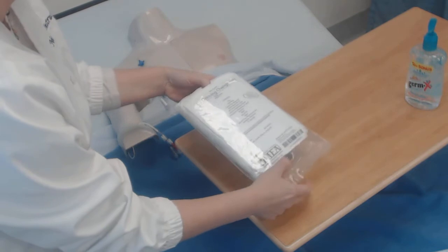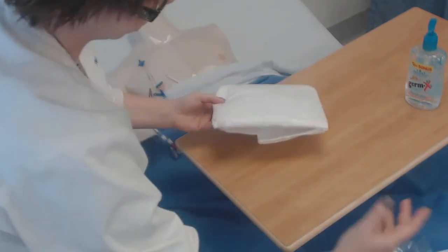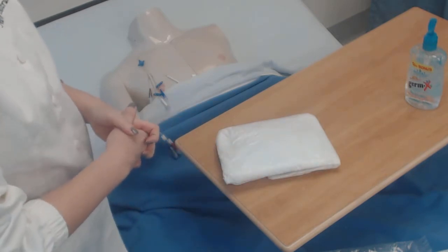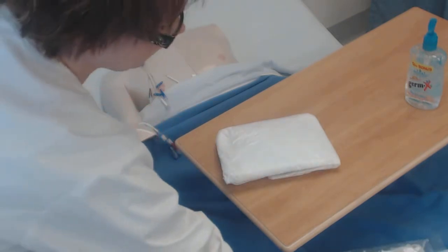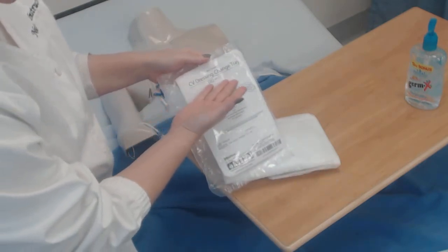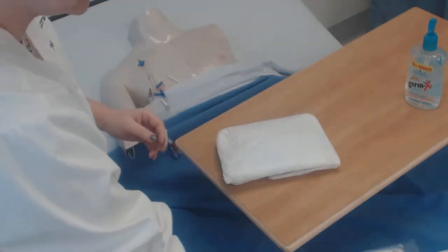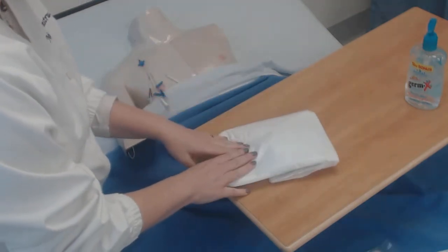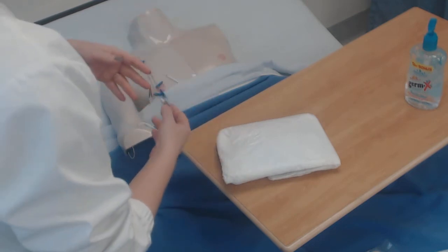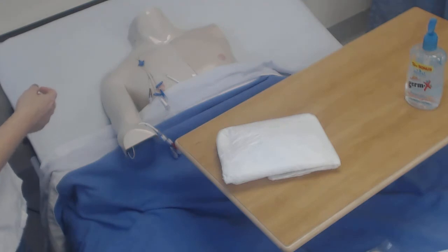These dressings will be changed depending on what's running — every 48 to 72 hours, and that again depends on your hospital policy. Right now I'm going to use a CV dressing change kit. You might not always have these, so you need to pay attention to what's in the kit so you can gather your supplies separately. It's very important that you have the supplies you need before you get started.